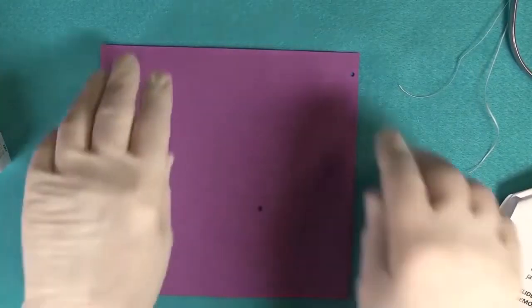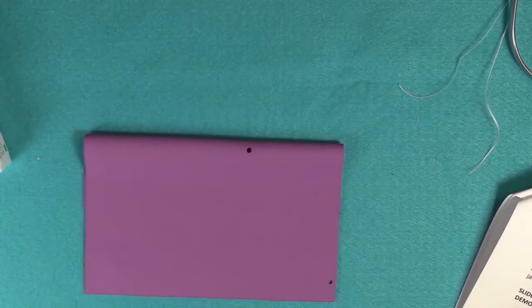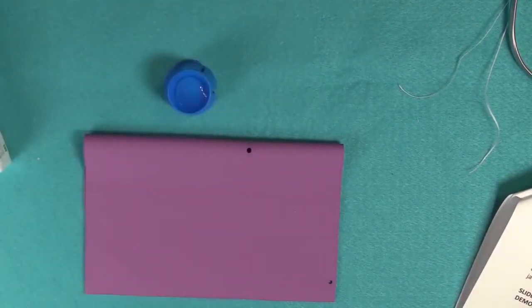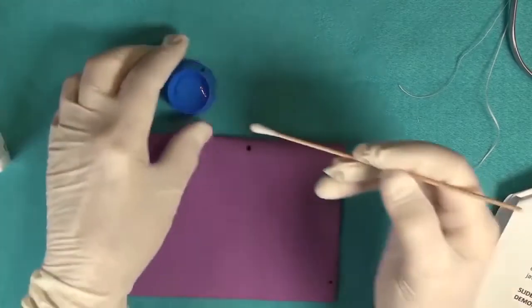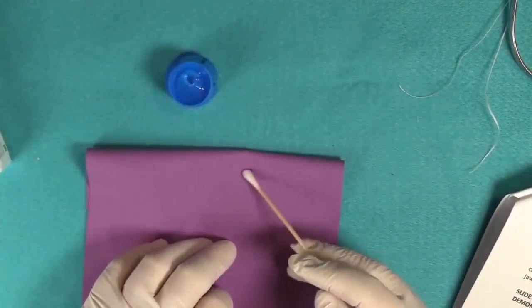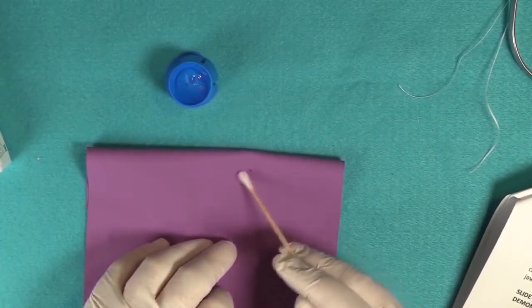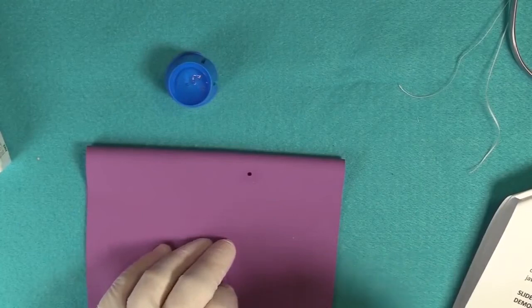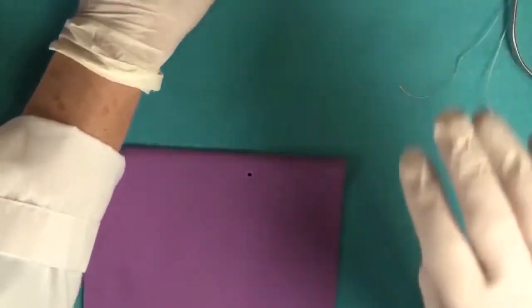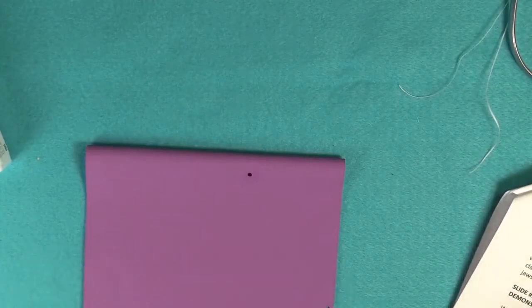Yeah. So now, when we use a wingless clamp, in order for the dam to slip over the clamp very readily, we're going to use a water-soluble lubricant, such as a surgical jelly. All you need to do is place a little bit on the side of the dam that goes towards the patient's mouth. That's commonly called the tissue side of the dam. You don't need a lot, just enough to lubricate that.